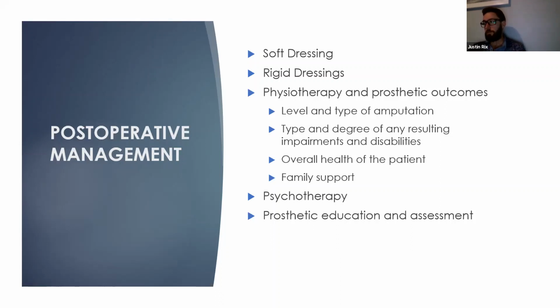The amount of the resultant traumatic edema determines when the patient can be fitted with a prosthesis. We generally fit the patient with their initial socket 8 weeks post amputation, but the residuum can still take up to 18 months to settle, and even then is still not 100% settled, as weight gain or loss, as well as activity levels, can cause the residuum to increase or decrease in size and in volume.